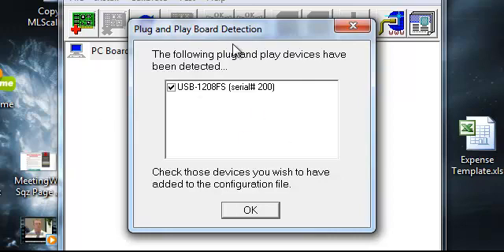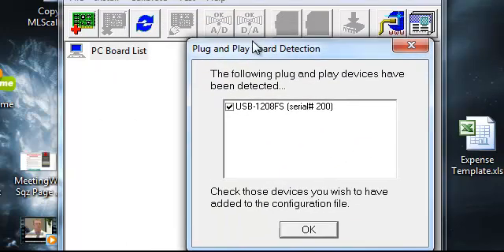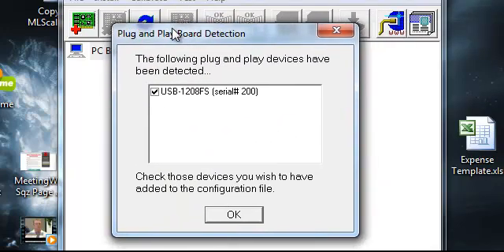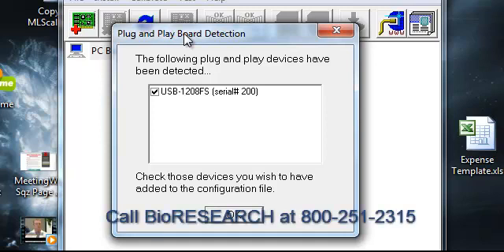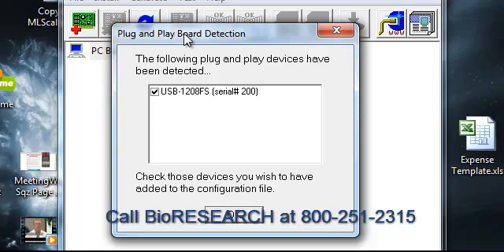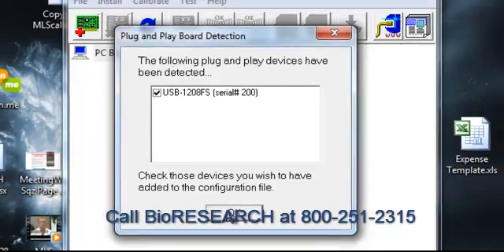If you don't get this second window on top here, this one that I'm moving around here, what that means is it's not picking up the device. And what I'd recommend is first trying to restart your computer. If that doesn't work, give us a call here at BioResearch at 1-800-251-2315.